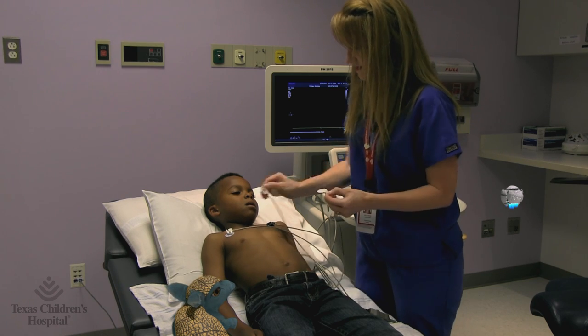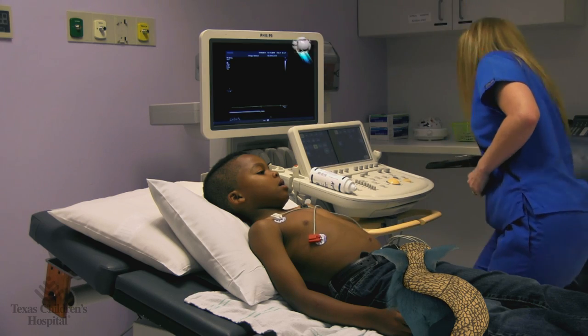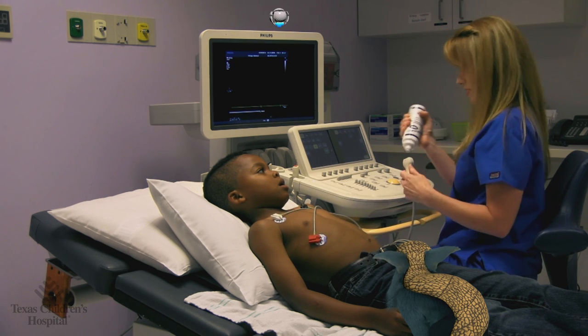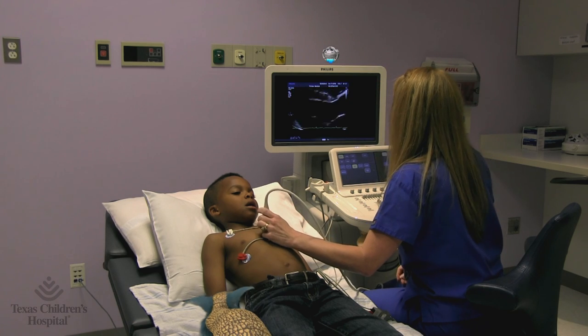Hey, can I have one of those? I'd give you one, but you never give them back. The bottle of gel's been in the warmer, so it shouldn't be cold. It's a bit gooey, but it won't hurt.